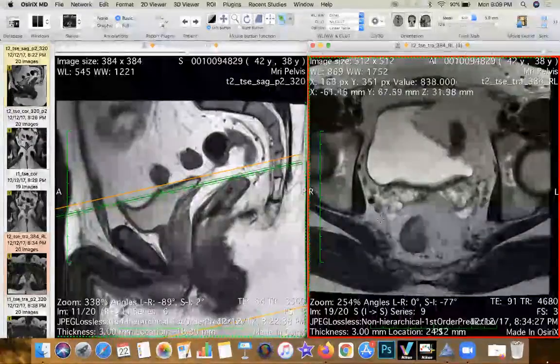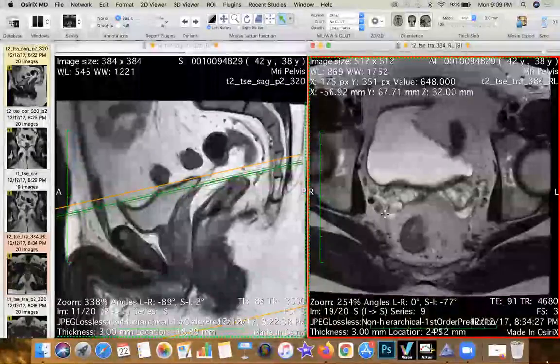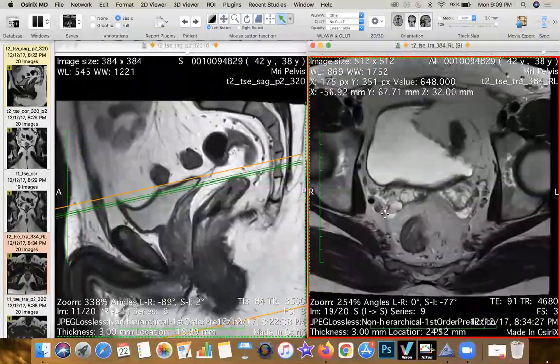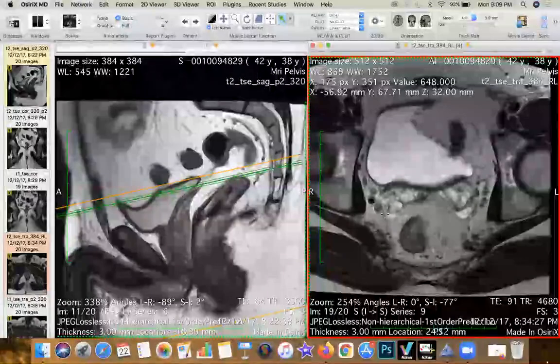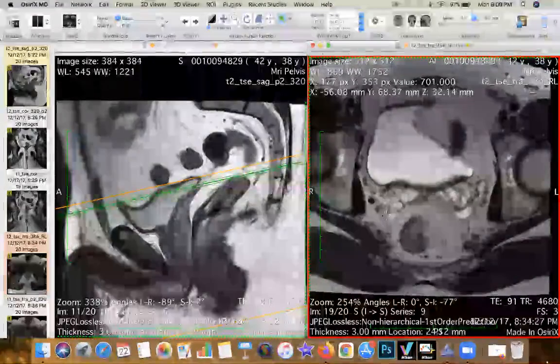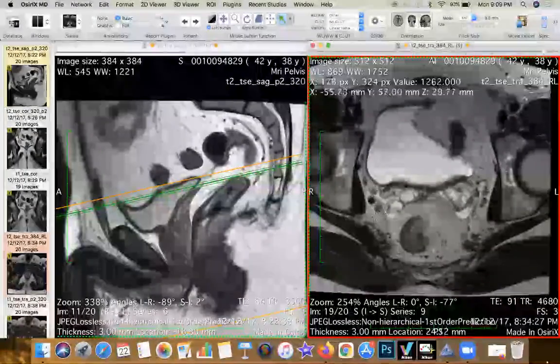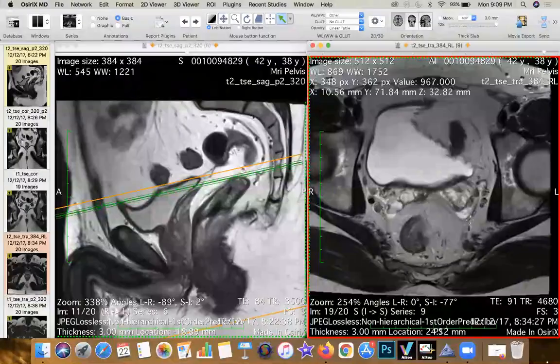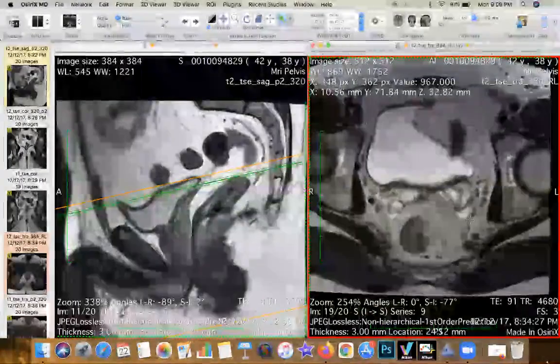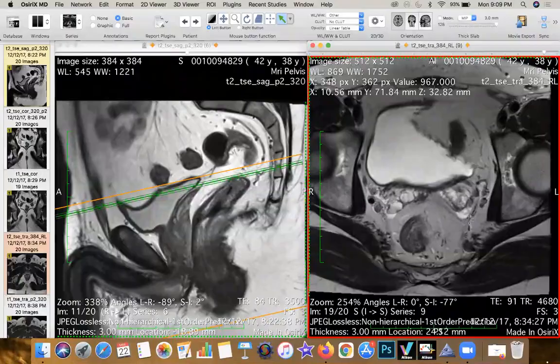The junction at which the visceral endopelvic fascia, that is the mesorectal fascia, meets the seminal vesicles in men, or in women, where it meets the outer edge of the uterosacral ligament as it arcs along the torus uterinus, you have a very key structure which is very important in terms of the functionality of the pelvic diaphragm and the perineal structures, which is called the hypogastric plexus. You need to identify that in most of your cases, where your pelvic floor anatomy needs to be read very carefully.